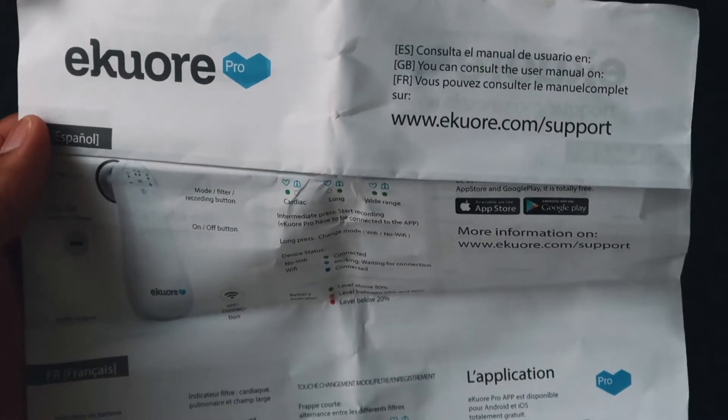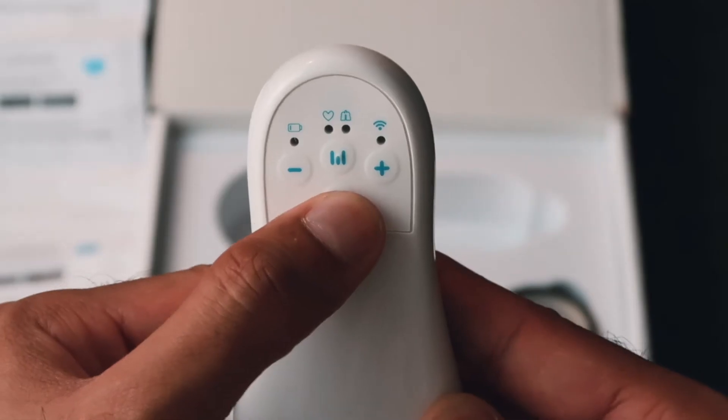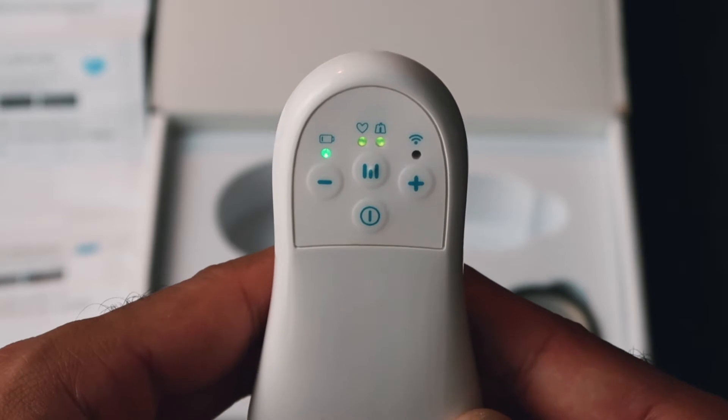There's an instruction manual, which hopefully is in English as well — yeah, they've got an English part of it. So: instruction manual, head of the stethoscope, and the actual stethoscope itself. There are a few different lights on the stethoscope — there's a light that has a little battery symbol on it, a light that has a heart and a lung symbol, and a light that has a Wi-Fi symbol.